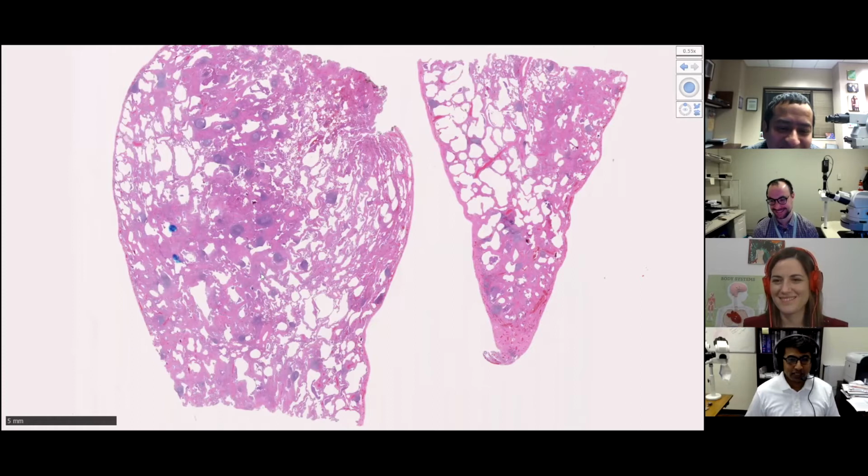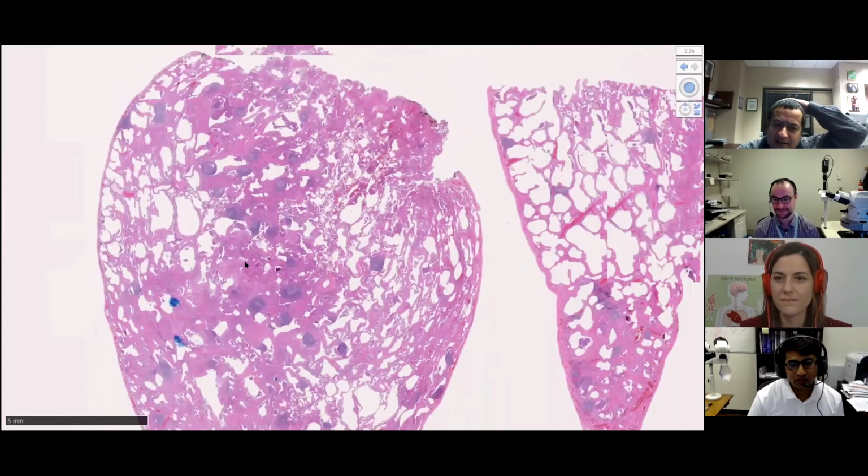So this is a bigger biopsy than transbronchial cryobiopsies. Obviously, you can see you have the central areas, peripheral areas, the pleura, and everything, and the tips of the biopsies are also present, if that is relevant. So, Raghav, can I ask you one second?